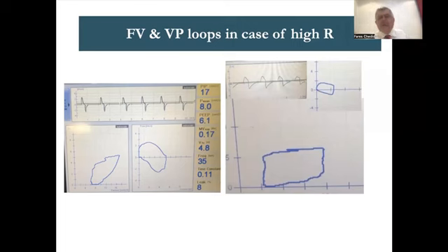So this is compared to him, a patient. I'll tell you his story, but before telling the story, I'll show his graph. This patient is having a short inspiratory time because the flow is not reaching zero here.